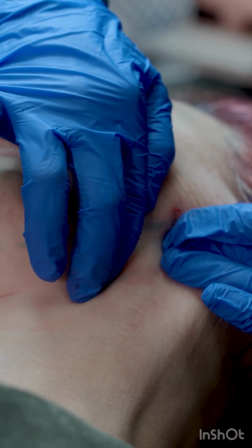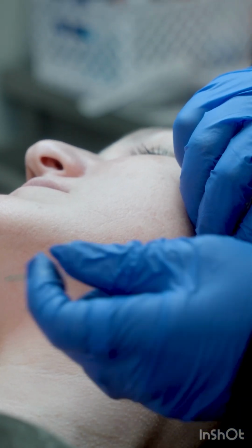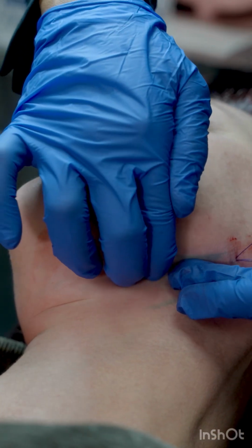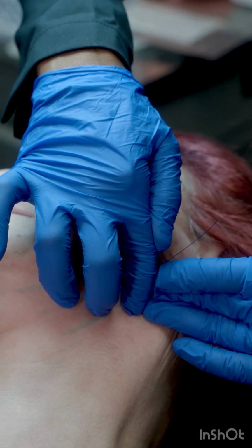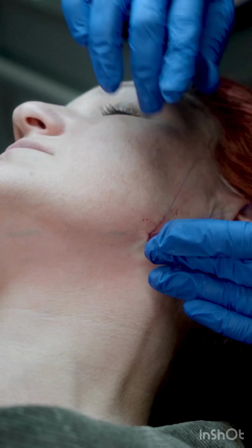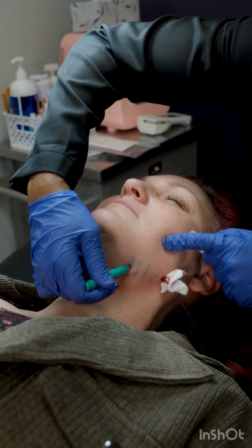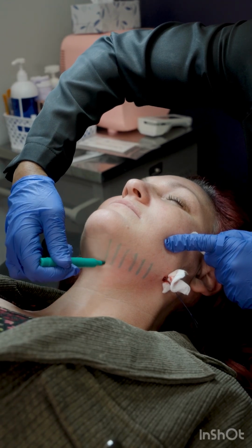Once all the threads are inserted, again, I engage them by ensuring that they are locked in place in the tissues, using my fingertips to engage all the barbs underneath the skin. Now all the threads are in place, and as you can see, she's already having changes in the appearance of her neck. Now I am going to perform what is called a Nefertiti neck treatment using PDO threads.